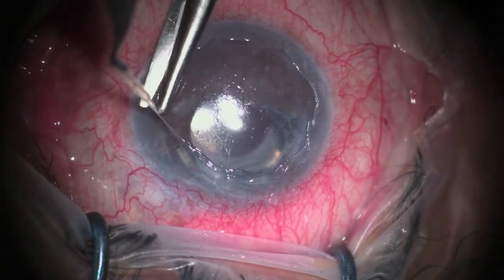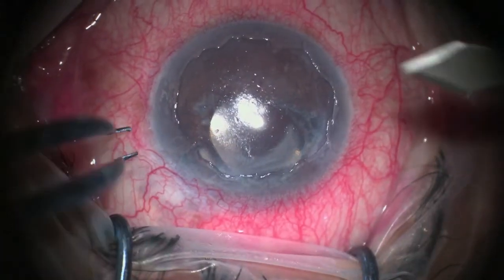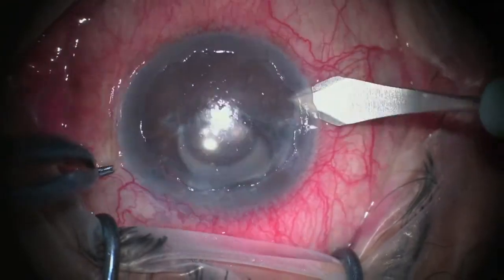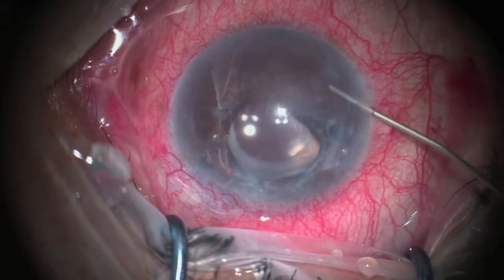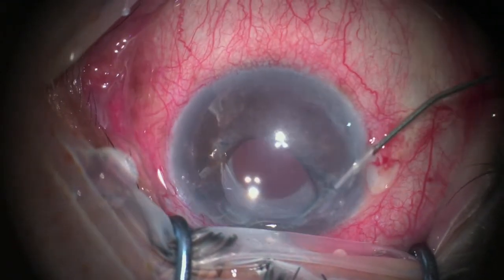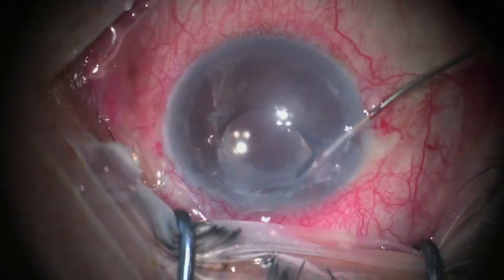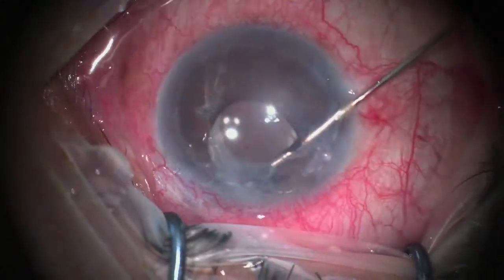After removal of the epithelium, a paracentesis is then done, followed by injection of viscoelastic and trying to free all iris tissue adhered to the cornea. As we can see, the viscoelastic cannula is used to cut all the adhesions and to free all the iris tissue.